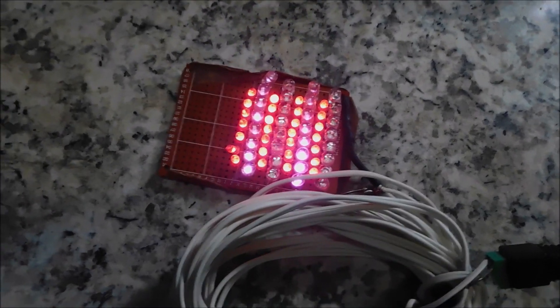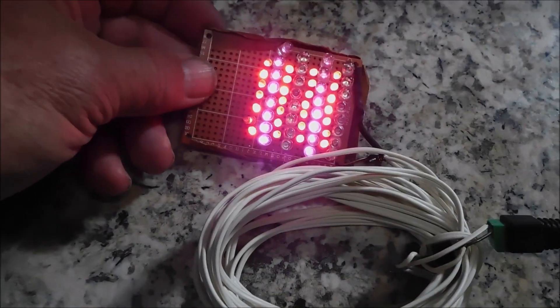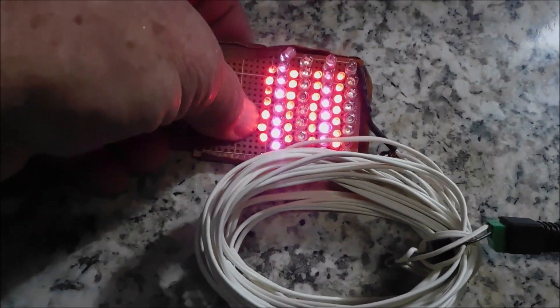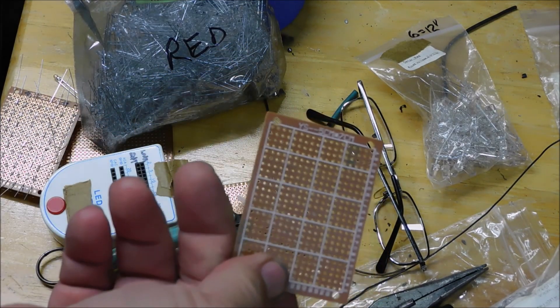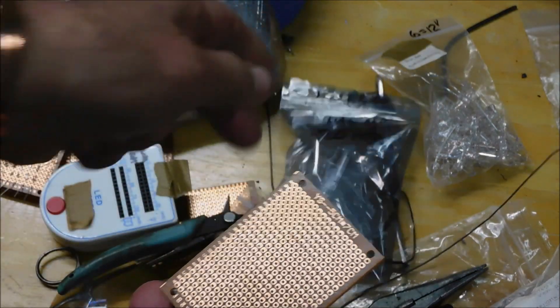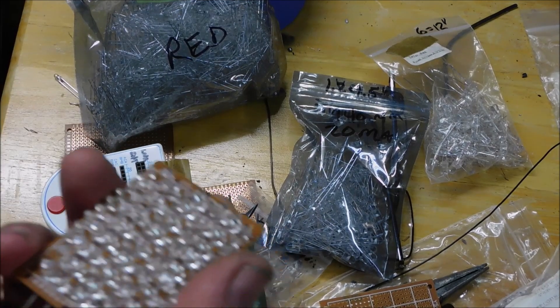I'm going to put in three and see how that goes, so we'll move on to the next part of the project. This experiment was successful — it takes care of pain like you wouldn't believe, so it does work. My project is to put a bunch of LEDs onto a board. I have a perf board — five centimeter by seven centimeter — and copper clad, which is what I'm using to mount my LEDs.